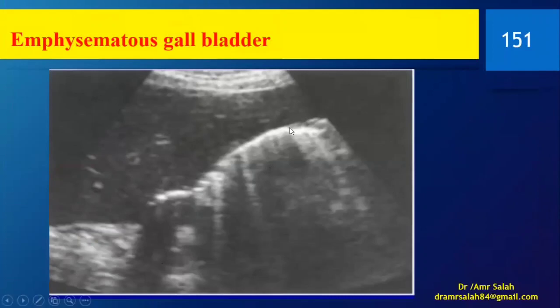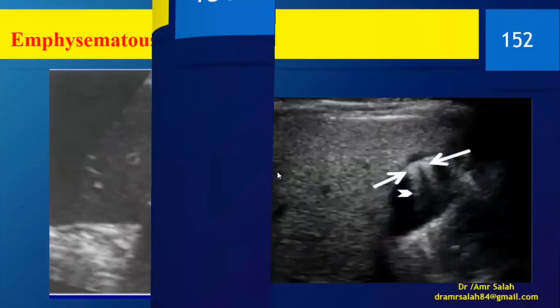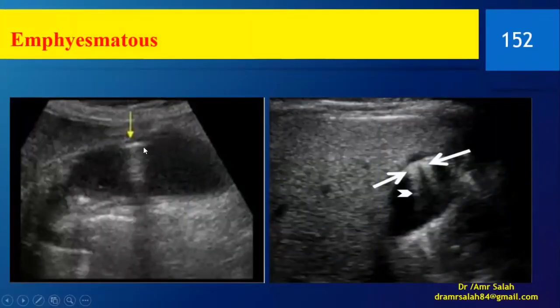And that's why it's very important, if you do not see the gallbladder, and the patient has told you that he is actually fasting and hasn't had the gallbladder removed, that you say that you have not seen it. Do not just overpass it and say, okay, it's contracted. No, just try in order for it to be seen again, follow up, schedule another visit so that it can be investigated, because the patient might be diabetic and might have this condition, and this might be overlooked as contracted or something, and he might have this very grave condition.